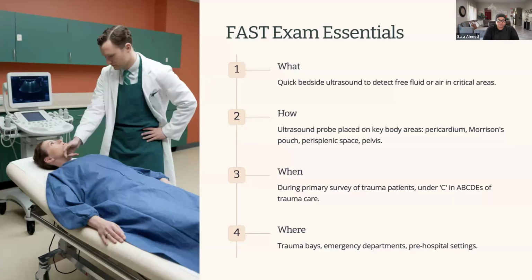To recap, the FAST exam is a rapid bedside ultrasound that checks key zones for free fluid and air in a trauma patient. It's performed during the primary survey, especially in patients with signs of shock, to quickly identify life-threatening injuries. Its portability and speed make it invaluable in trauma care worldwide. And it's a must-know for the USMLE Step 3.